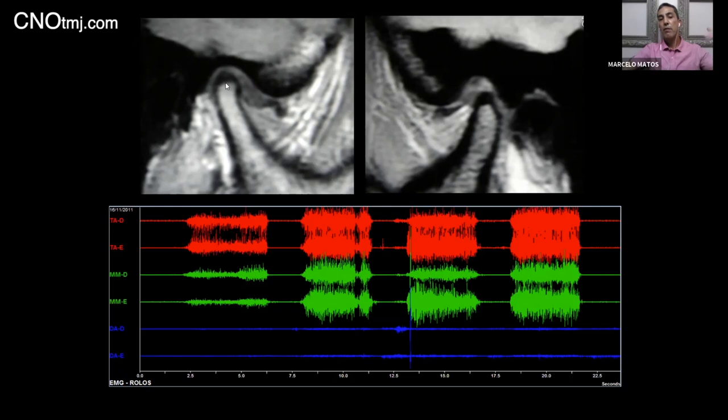So it's not giving enough hypersignal to generate the image we should see. It gives the same kind of image as the cortical, and we look and think that it is a thicker cortical, but it is not. This is degeneration going on. Anyway, in both cases, right and left, the situation is not a nice situation to sustain force.